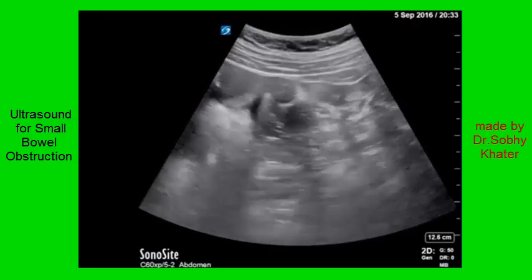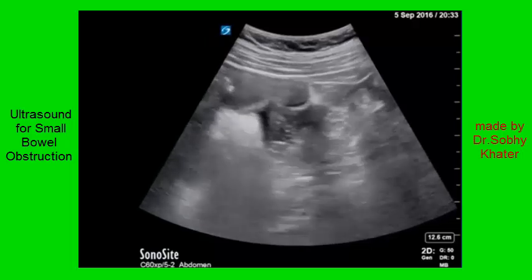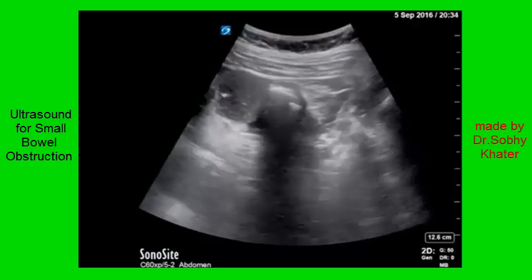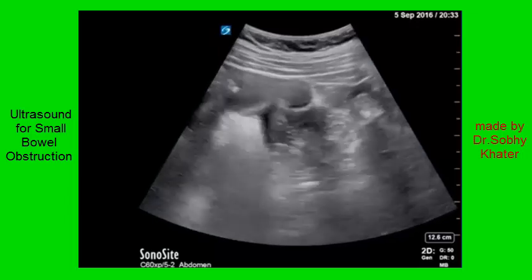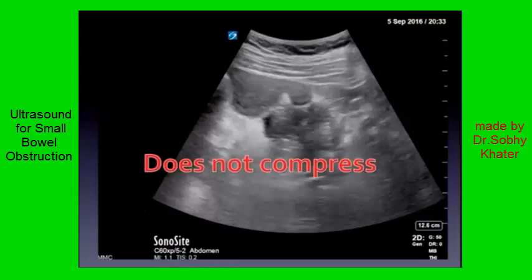Likewise, in this next clip, what I want you to make out is the complete lack of compressibility. You can see right there at the beginning of the clip the operator is compressing the abdomen. The soft tissues around compress easily. These loops of bowel are not normal — normal bowel is easily compressible. This does not compress.